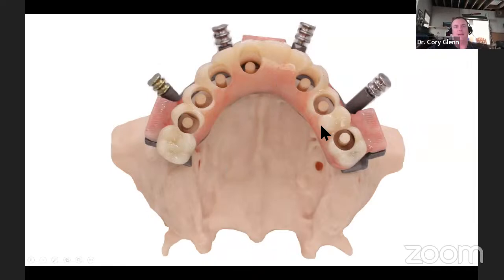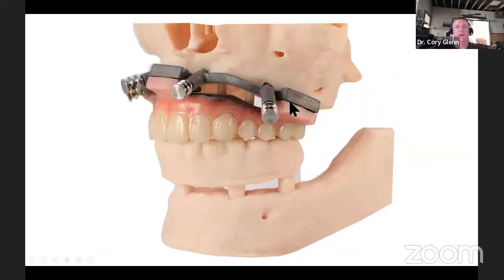All right. And again, hopefully after you place your implants and you put on your multi-unit cylinders, when you drop on this temporary restoration onto the magnets, hopefully you see that your cylinders are coming right out the center of each of these holes. And the only thing you're going to have to do is your pickup. Take your dual cure injection material, inject in the space between your temp cylinder and this to lock them together. And when that's set, you undo all the screws, you take this out. These little magnetic portions just get cut off. And now you have your hybrid.